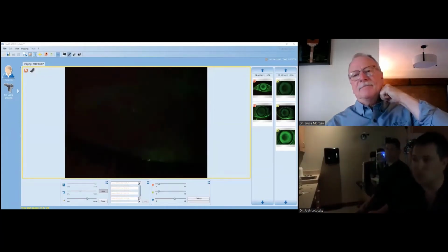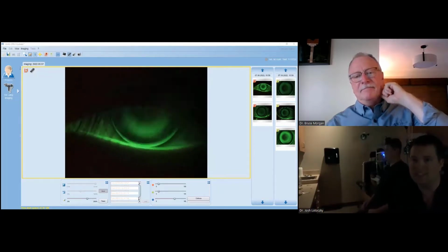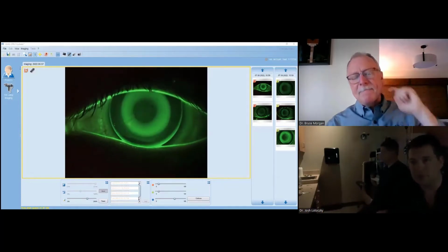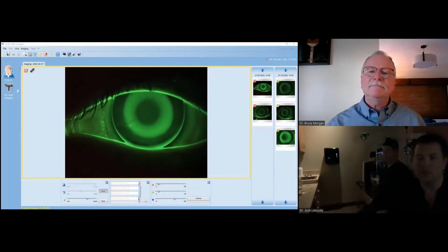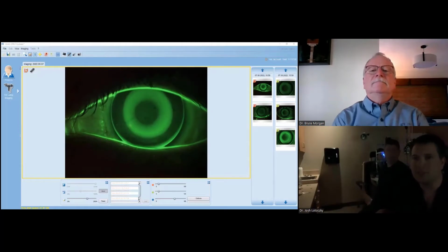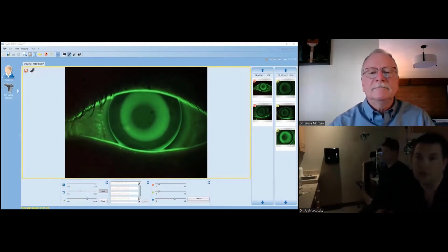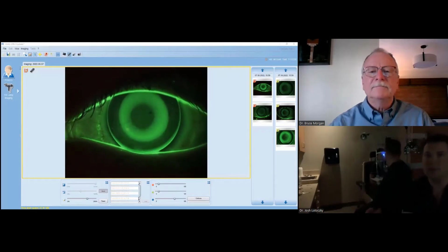And there are times where I might say, I'm going to potentially order a set of lenses that decreases that, and have them on hand for when you come back for your first follow-up. So, hey, if it doesn't work the way we want, or we're having any issues, we might have lenses available. I don't generally use that as my go-to, but every situation is a little different. And with the edges on this looking so good, I'm not as concerned, and I'd be more curious to see how it centers.